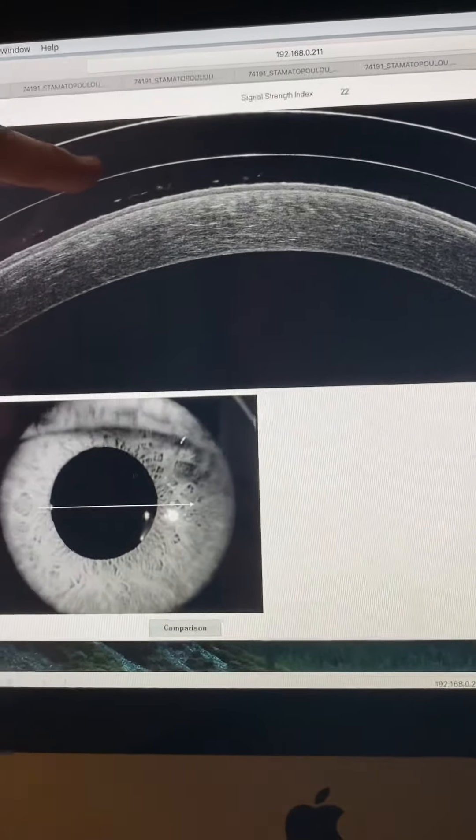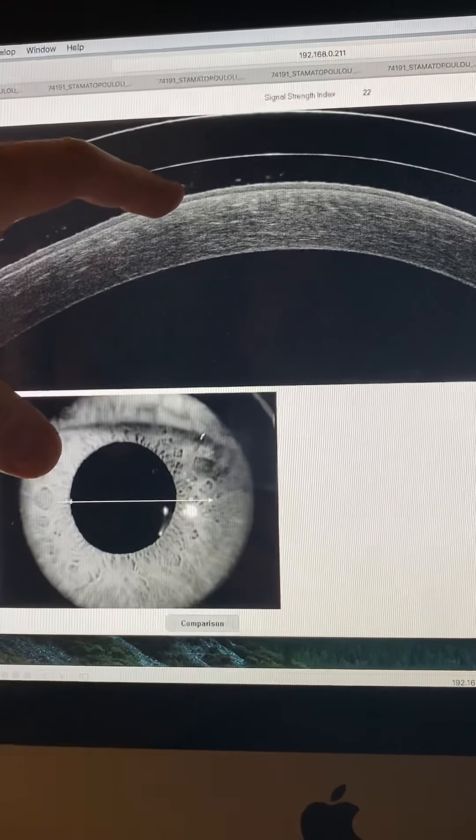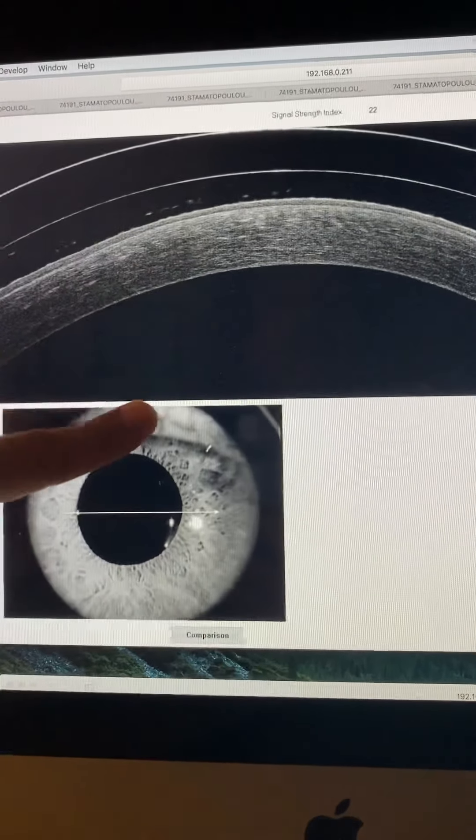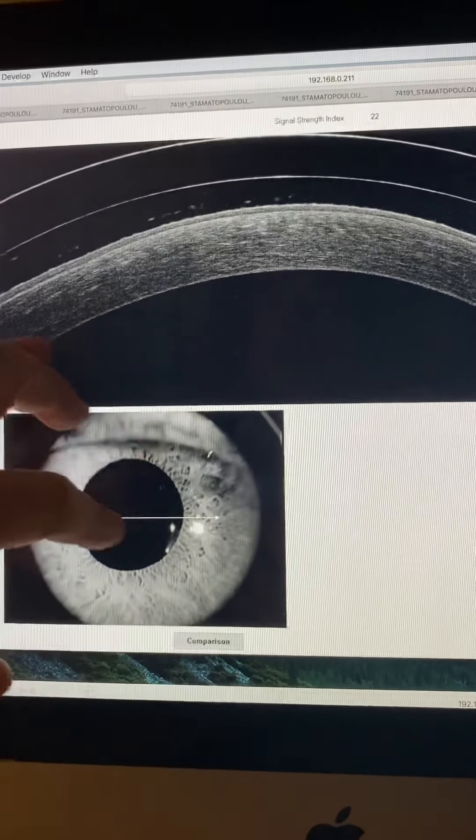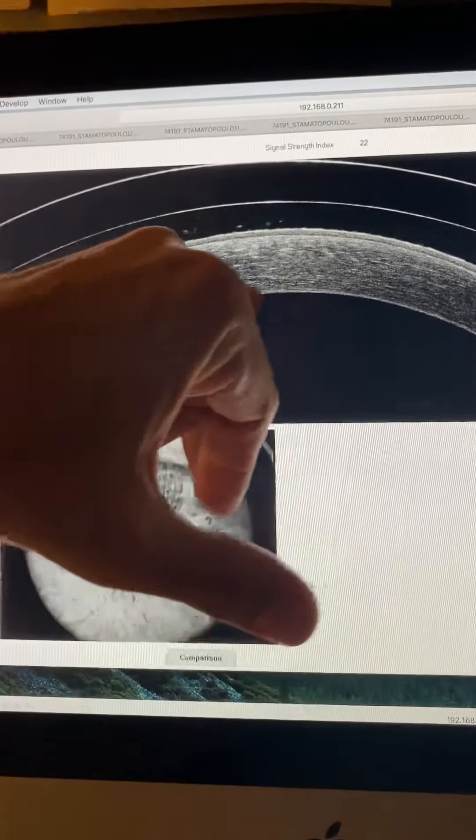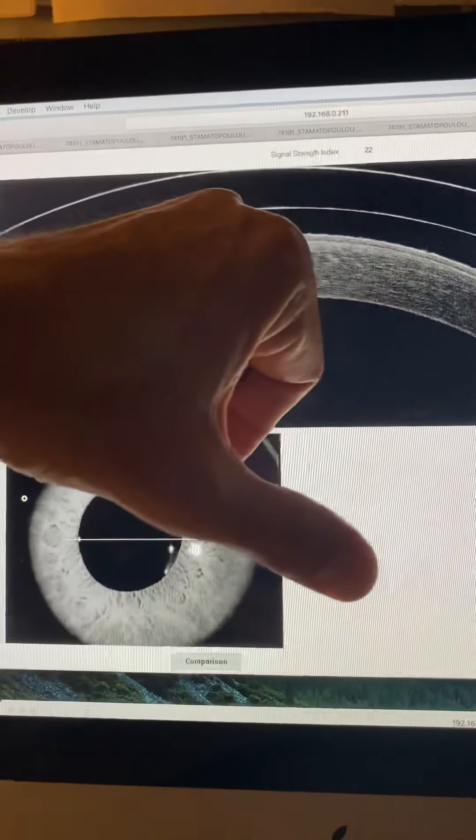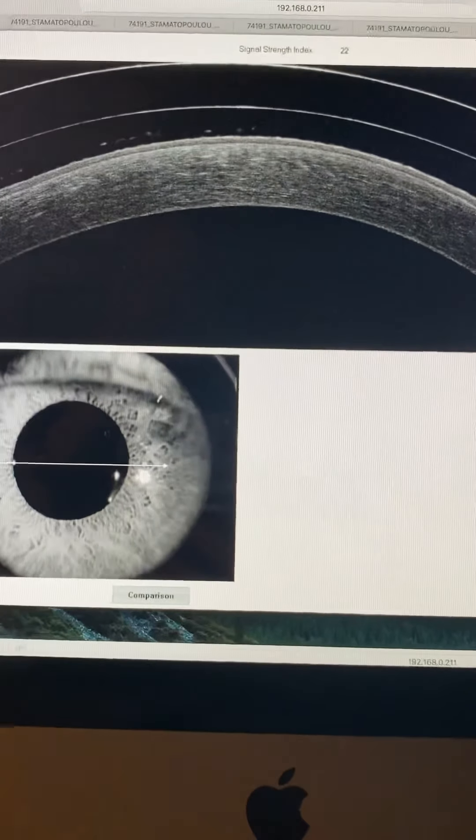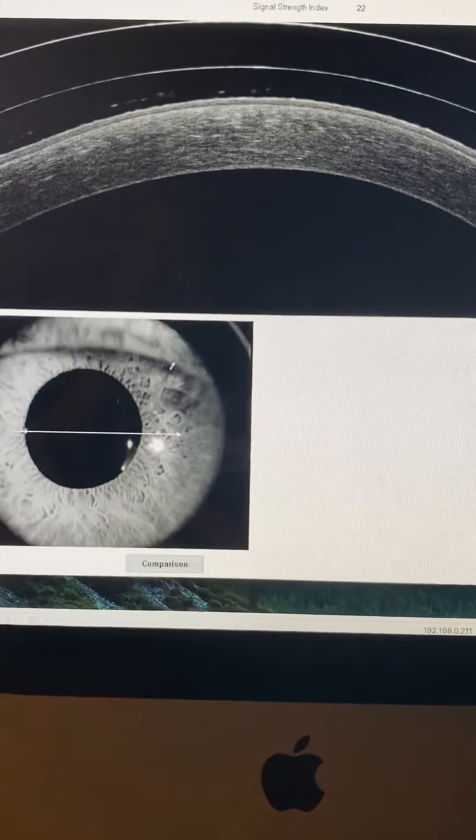We're seeing here the scleral lens, the fluid in between and the cornea. And maybe we're seeing cross-linking lines somewhere down here. And let's look at the edges of the lens.